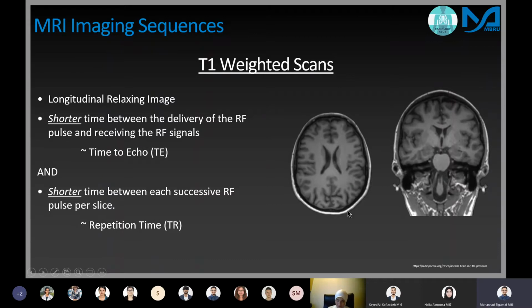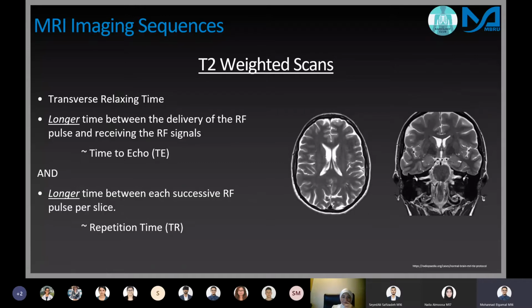You can also see, for example, does anyone know what this white structure around the brain is? Close. No, it's not the meninges. This is actually the skin. This white structure is the skin. Bones on MRI show as black. So here it's actually the skin, but yeah, trick question. The skull would be the black one around. So the most superficial layer is actually the skin. Actually, it's the fat under the skin, to be specific.